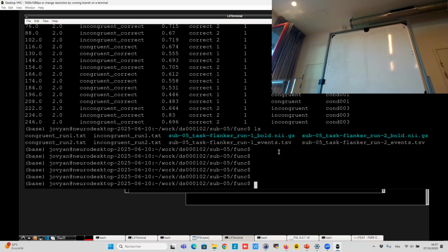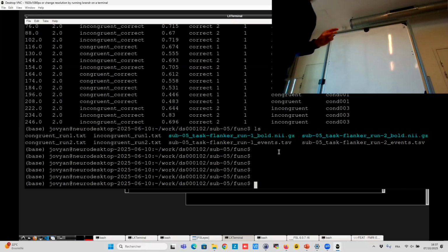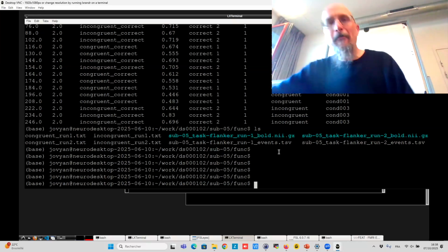These files are in the func folder. Does everybody have these files? Just check. No issue. Very good.